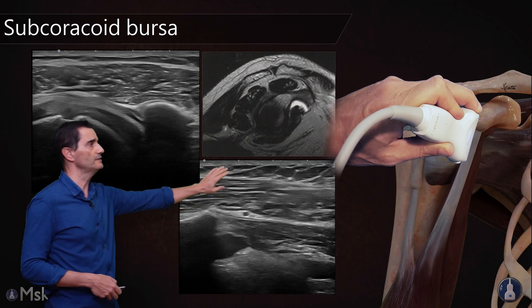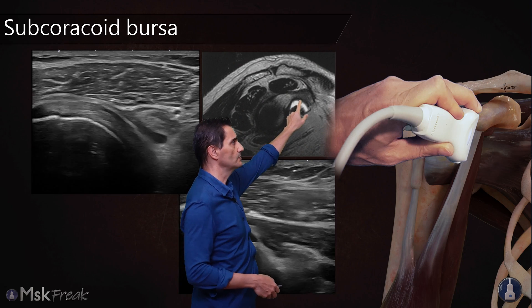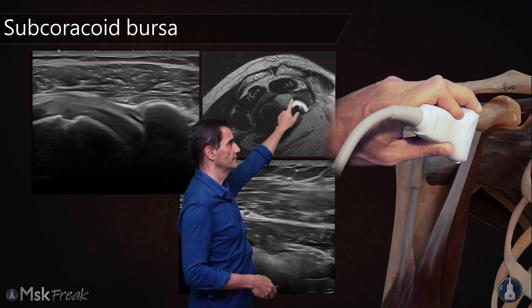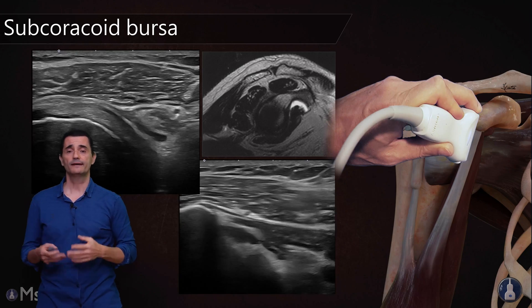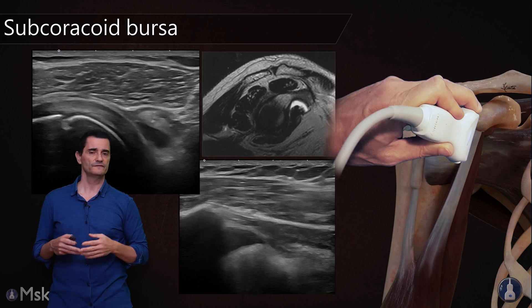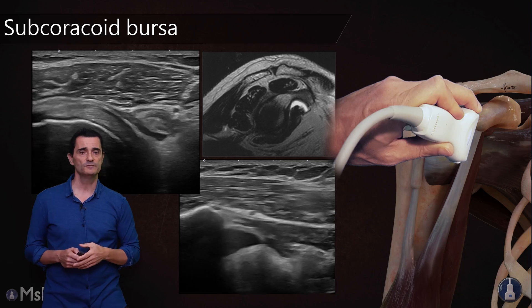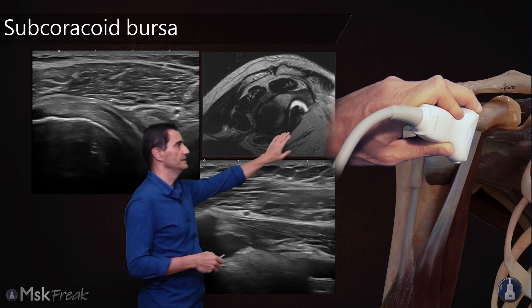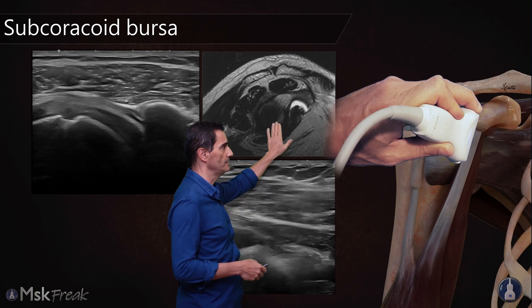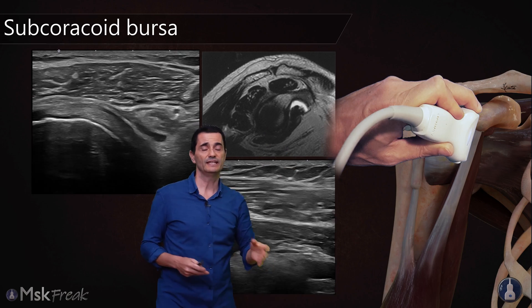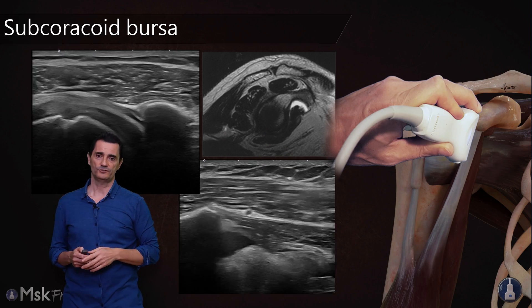You will understand better if you see the MRI. This is the subscapularis, and this is the subcoracoid bursa. I don't have examples of the subscapularis bursa because it's very difficult to see with ultrasound, but this bursa will be located deep to the subscapularis and slightly more medial, just in the anterior recess of the glenohumeral joint.